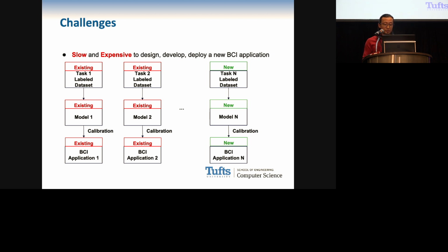And for each user, we need them to sit in the lab wearing the headband, and perform the task for several sessions, usually lasting over 1 hour. For our last paper, we collected 27 participants' data, and it cost us over 4 months. It's very, very time-consuming, not just for the subjects, but also for us, the operators.